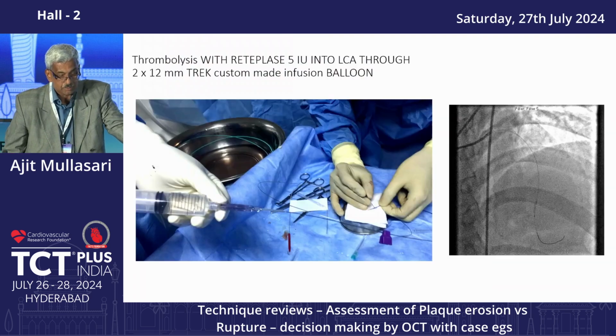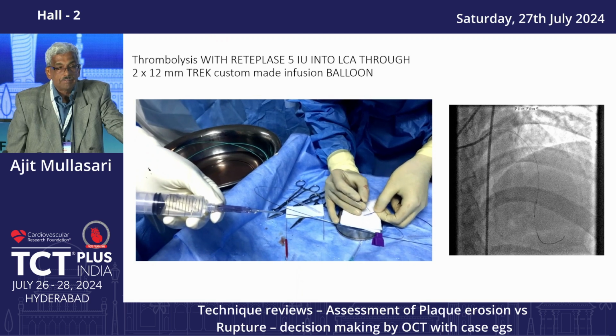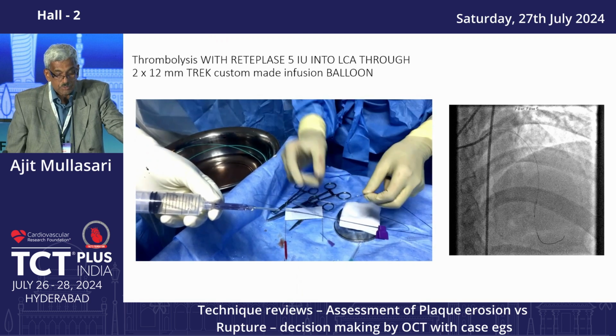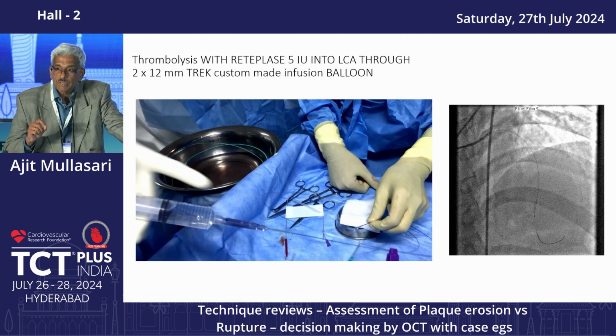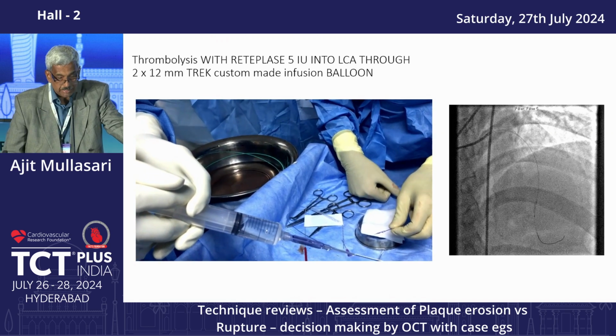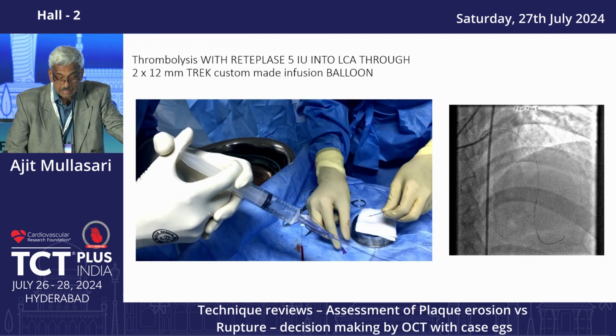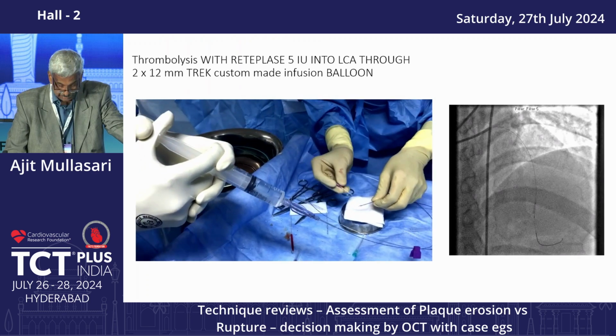So what do you do in this situation? We give lysis with reteplase. We used to have the Clearway catheter before, but now we use an infusion catheter by puncturing the balloon and giving an infusion of reteplase or any thrombolysis you want distally.